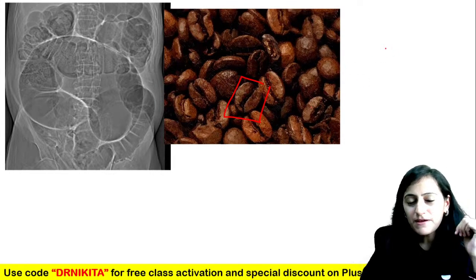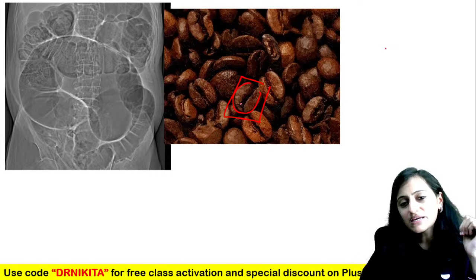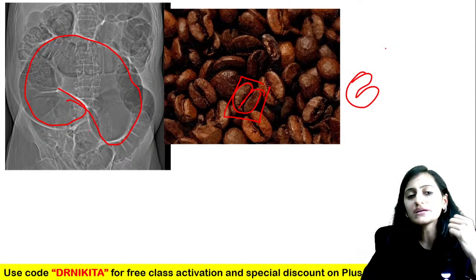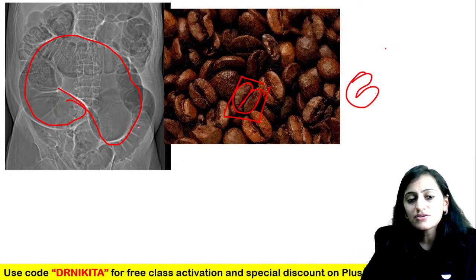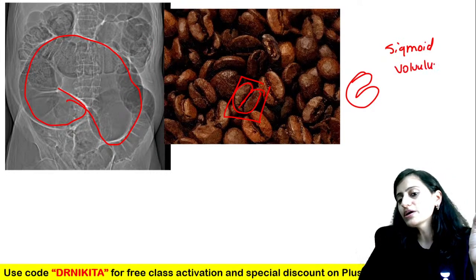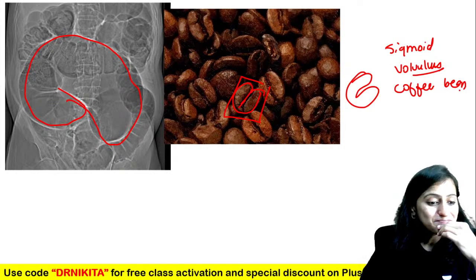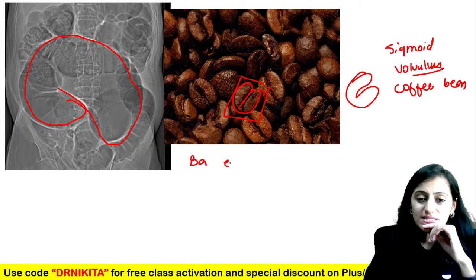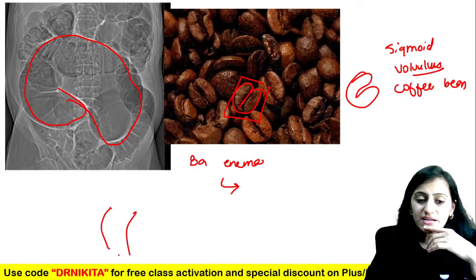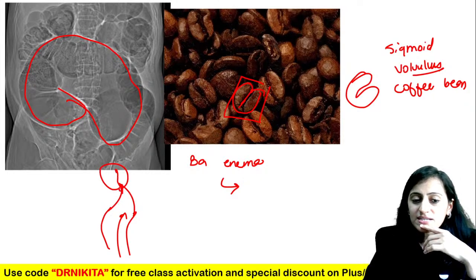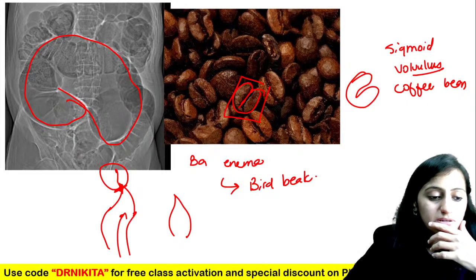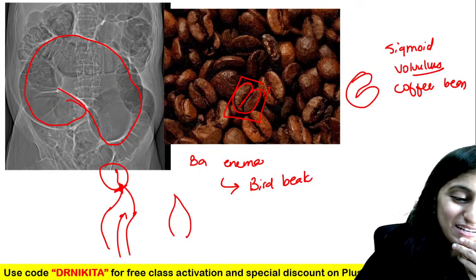The coffee bean sign — you have three lines converging, showing the coffee bean appearance. The proximal colon is dilated — descending, transverse, ascending — this is sigmoid volvulus showing the coffee bean sign. On barium enema, sigmoid volvulus shows the bird beak or bird of prey appearance — the barium goes into the rectum and at the point of volvulus gets halted.